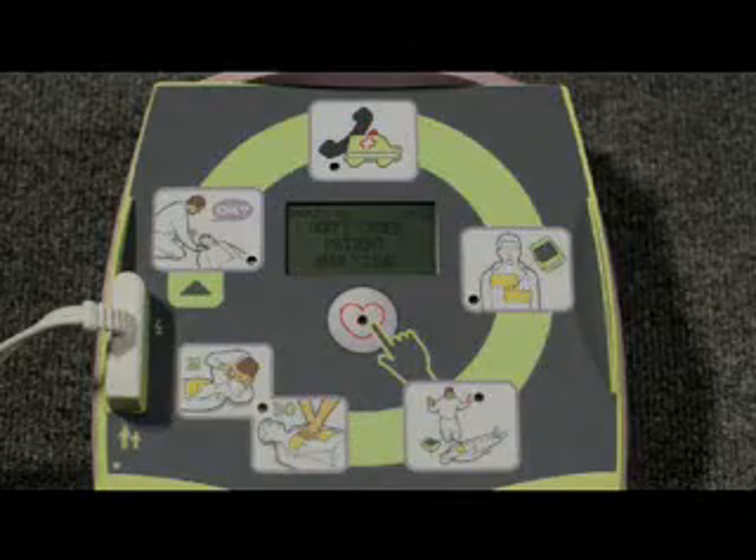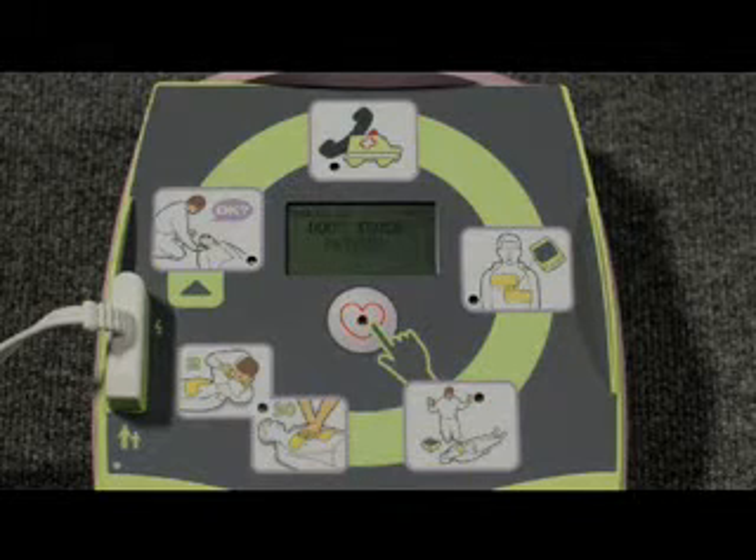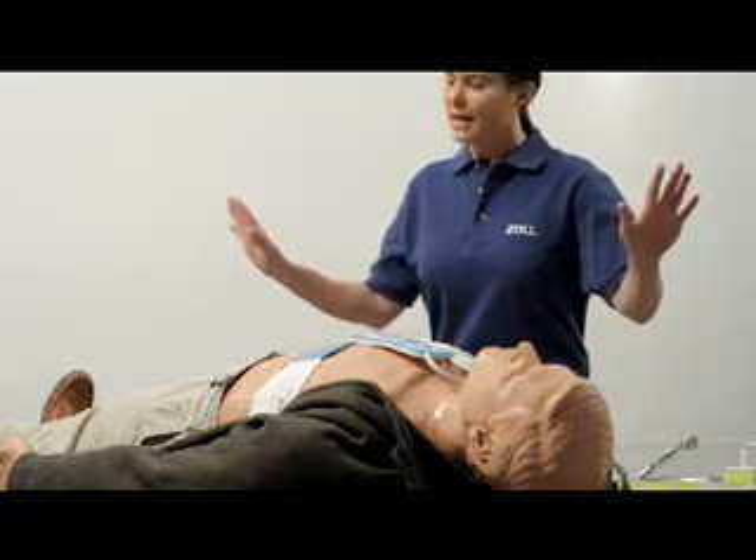Don't touch the person while the AED is analyzing the heart. If a shock is needed, be sure that no one is touching the patient.